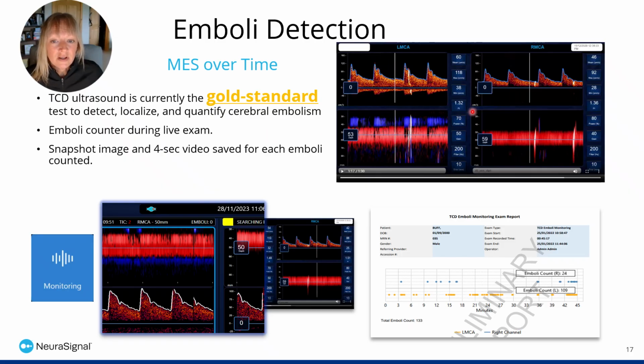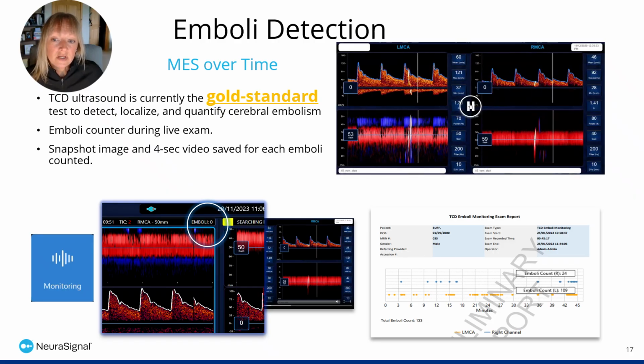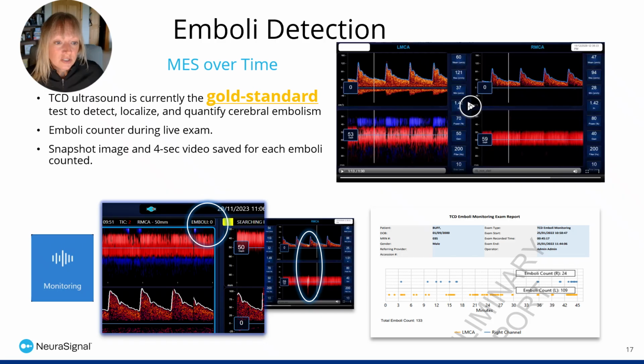We are able to identify emboli on a TCD, and it will have a unique sound, a popping, chirping, snapping type sound, different from normal cells. It will have a higher concentration of white within M mode and in the spectrogram, and our system will identify these high intensity signals on each of the images for us.